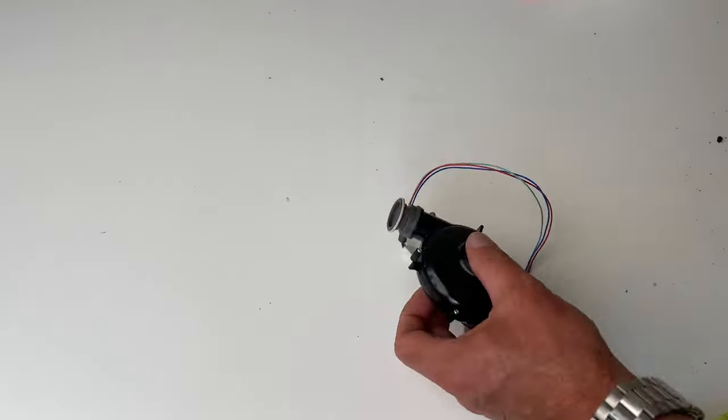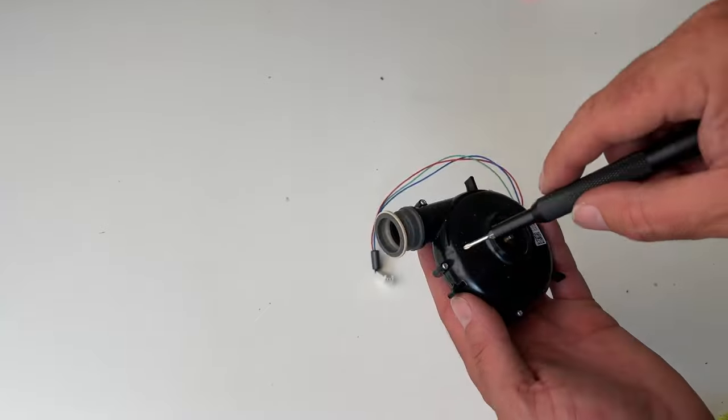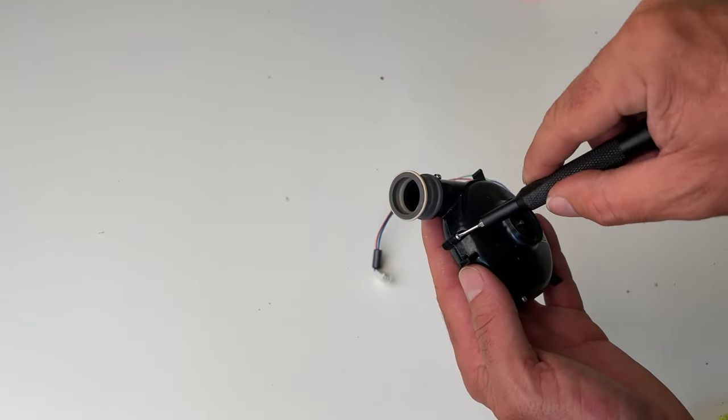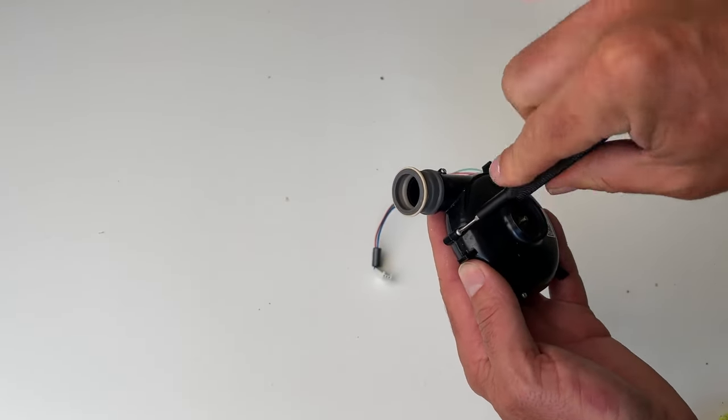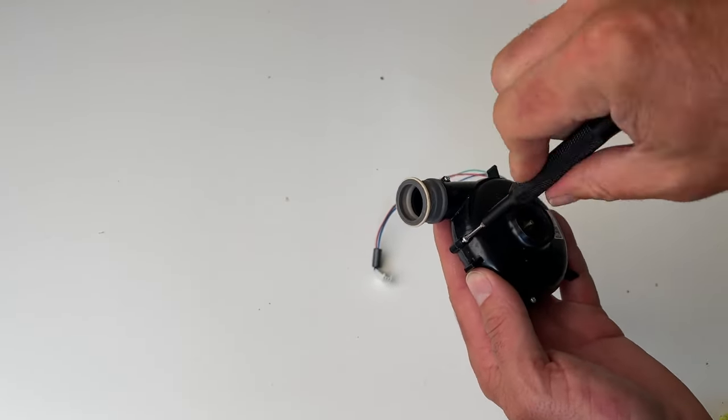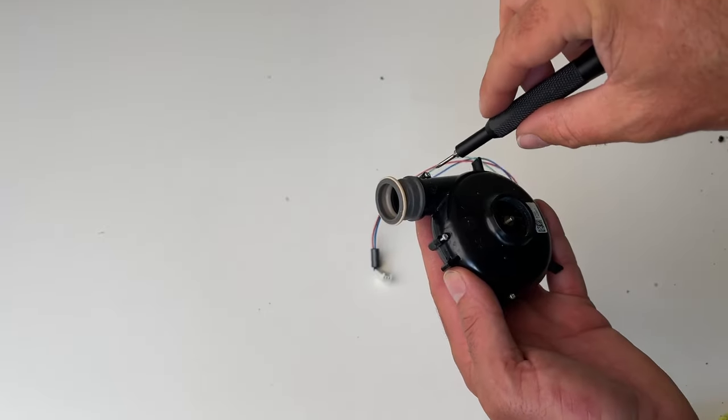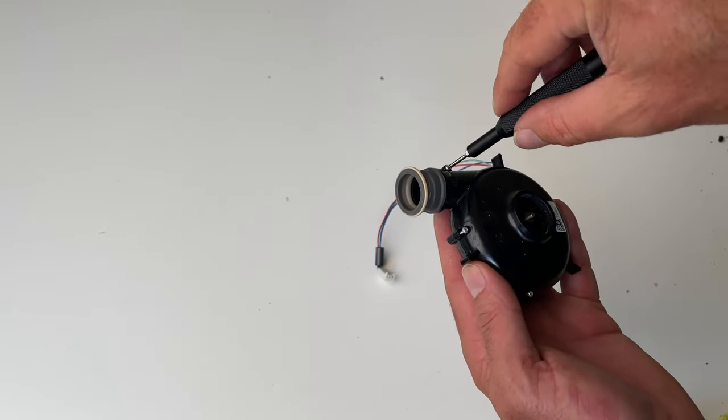Now, while you have taken your DreamStation 1 apart, you might as well, while you've done it, open up your turbine and give that a good clean as well.